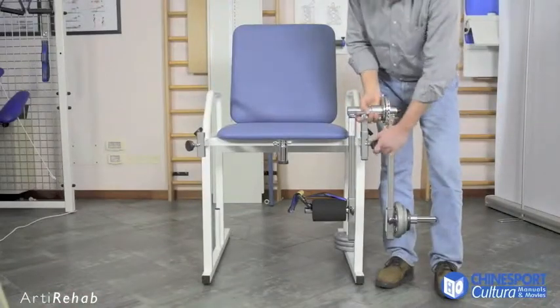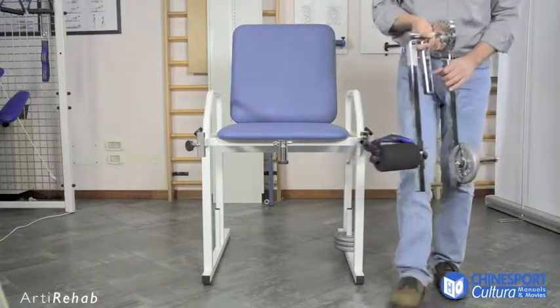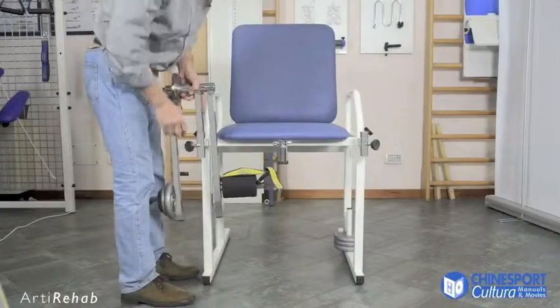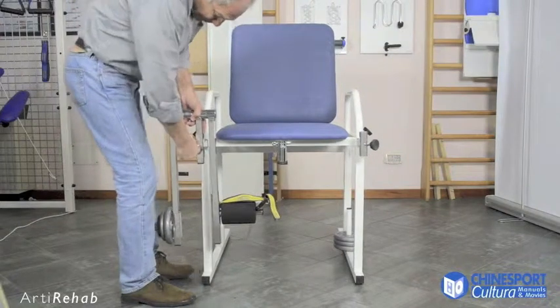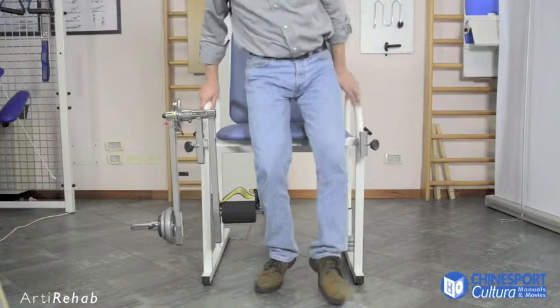To complete the description of this machine, the moveable arm can be moved for use on the other limb. The range of movement is adjusted again in order to precisely reproduce the work done with the other leg.